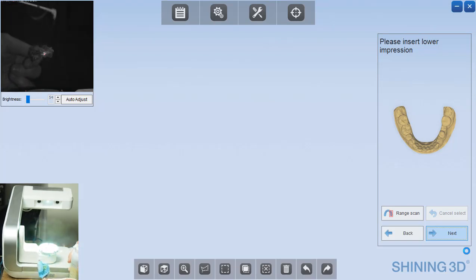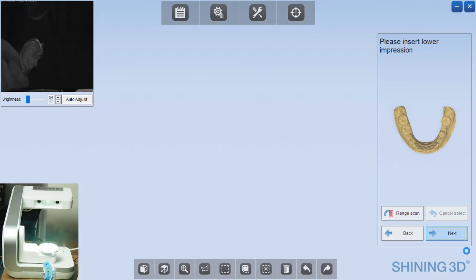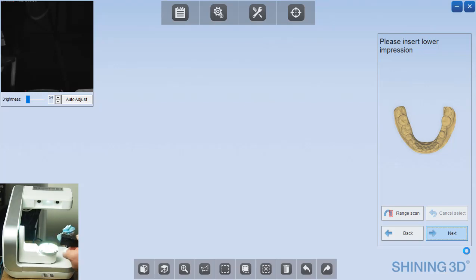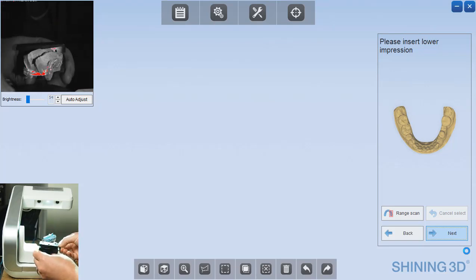Now you can see in the bottom left screen that I'm powdering this impression. PVS is generally pretty shiny and scanners do better when they don't have a shiny surface to read. So I'm just spraying a bit of powder onto that surface. That will knock all the gloss off.